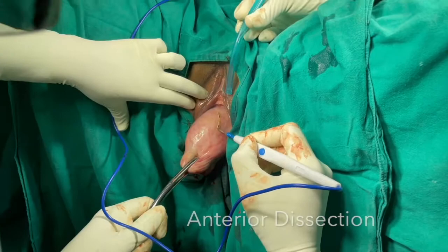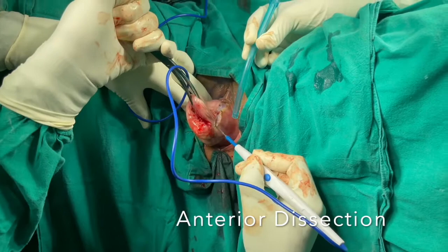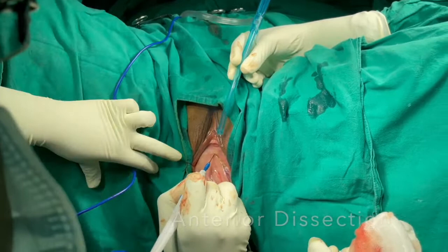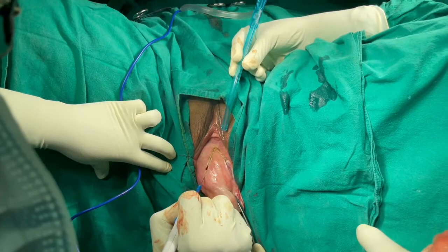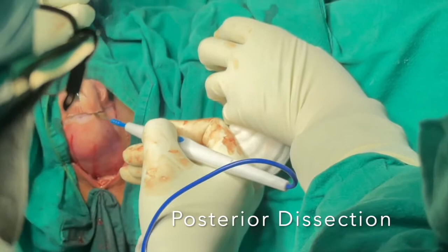The actual incision should join all the Fothergill points. In this case, with experience, I have not marked the Fothergill points. For the benefit of viewers, there are totally four Fothergill points: the upper Fothergill point is around 3-4 cm beneath the external urethra, two at the lateral fornices, and one at the posterior fornix.